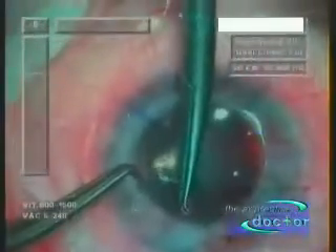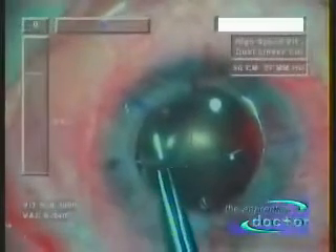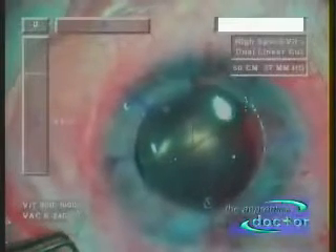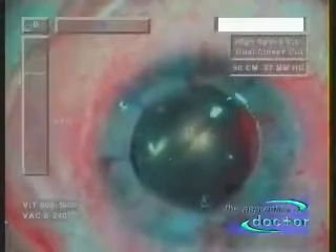The suturing is done under video magnification, enlarging the operative field approximately ten times. The suture thread used here is 10-0, attached to a C-shaped side-cutting needle.